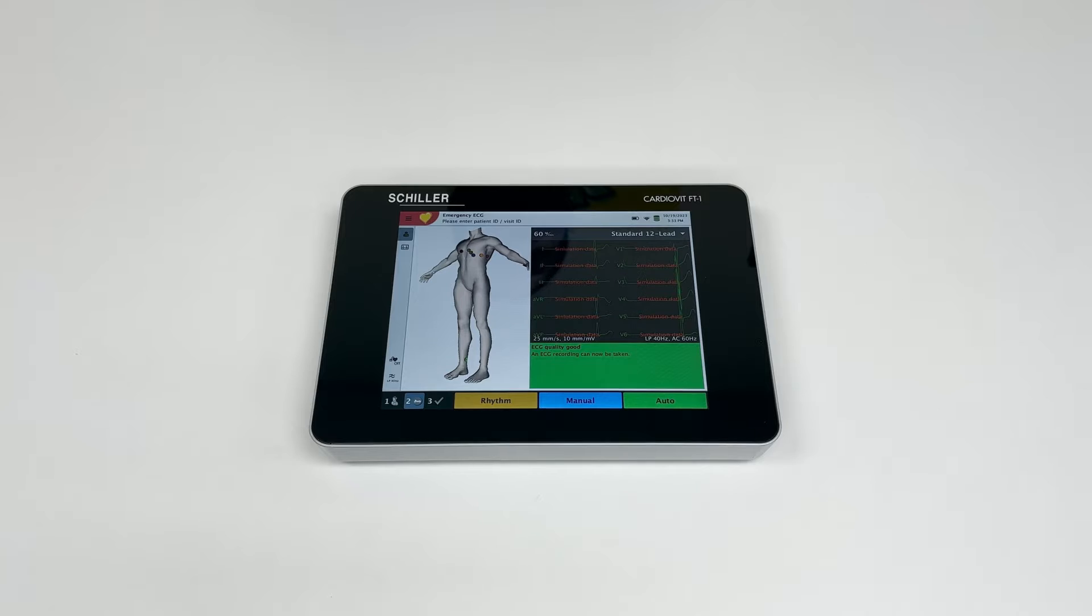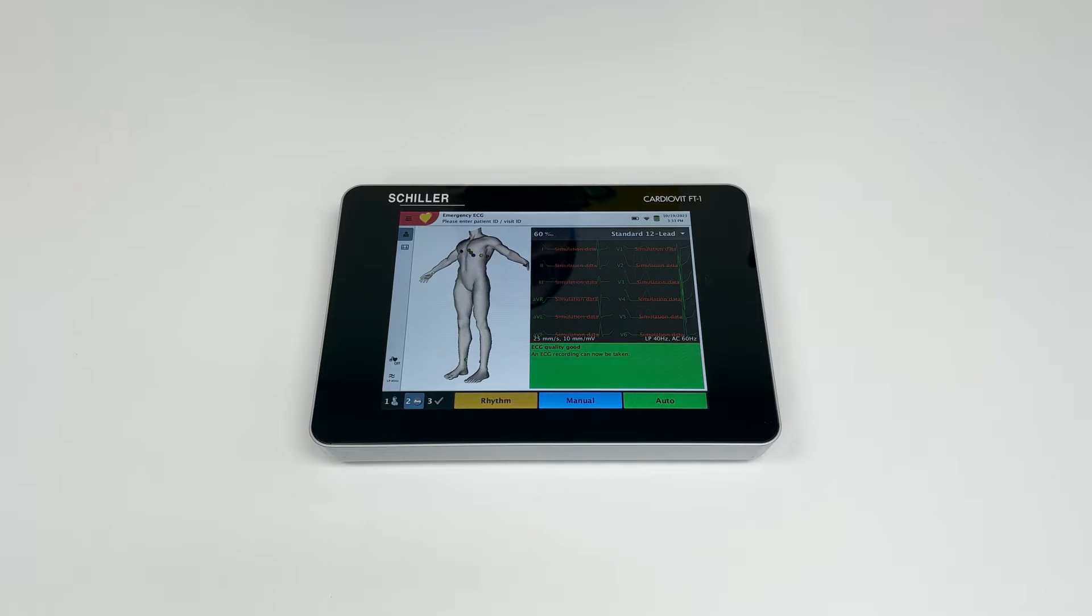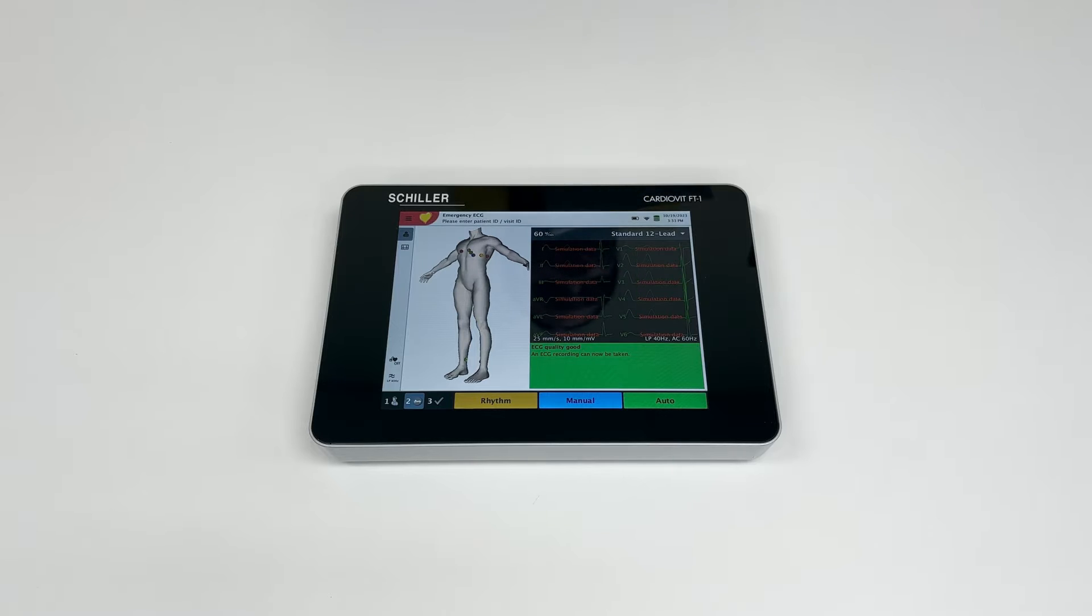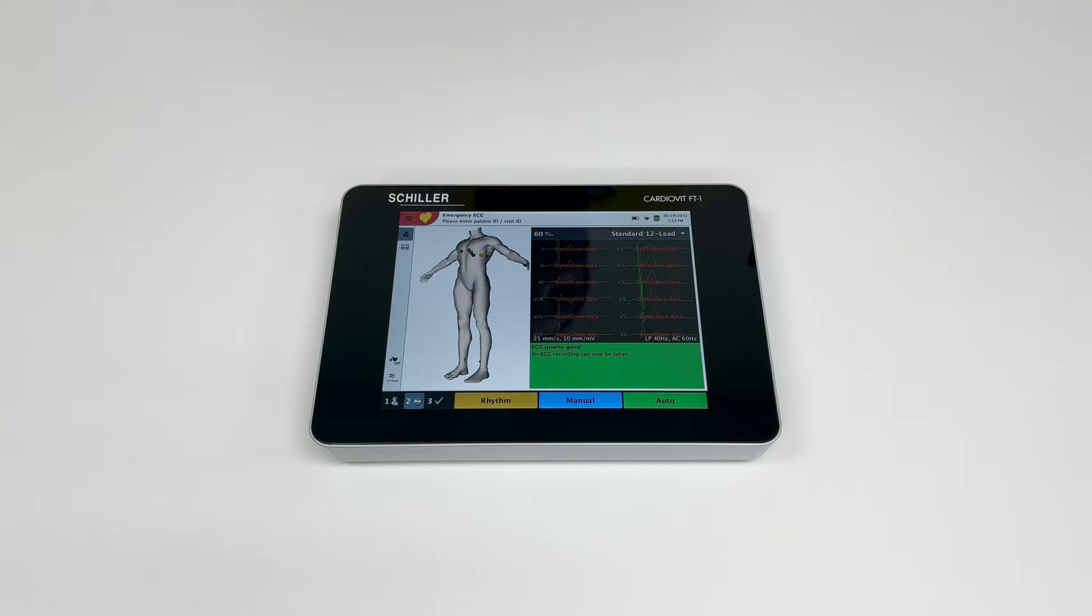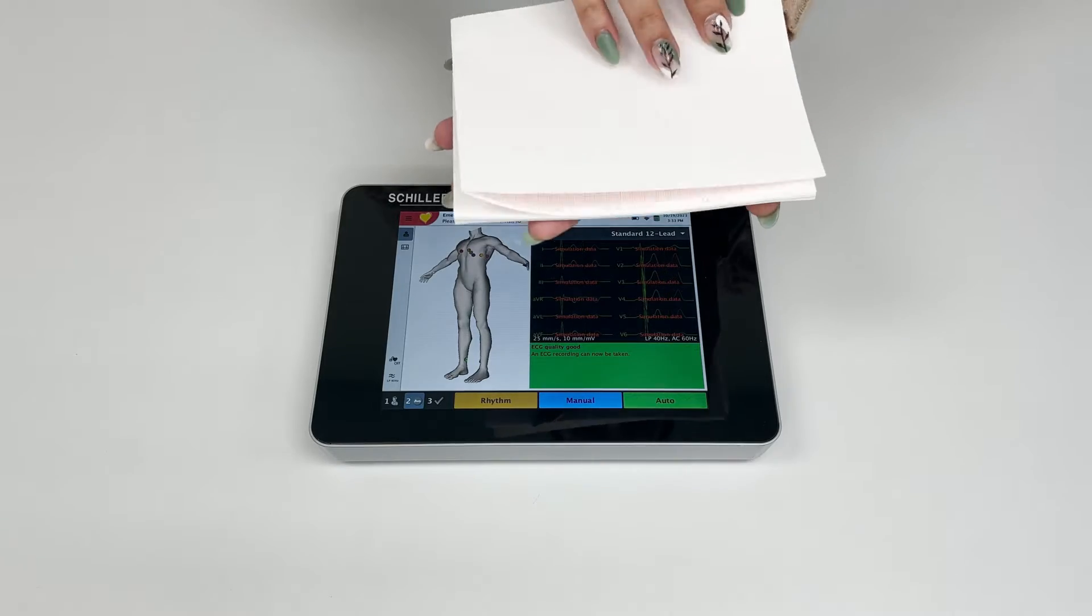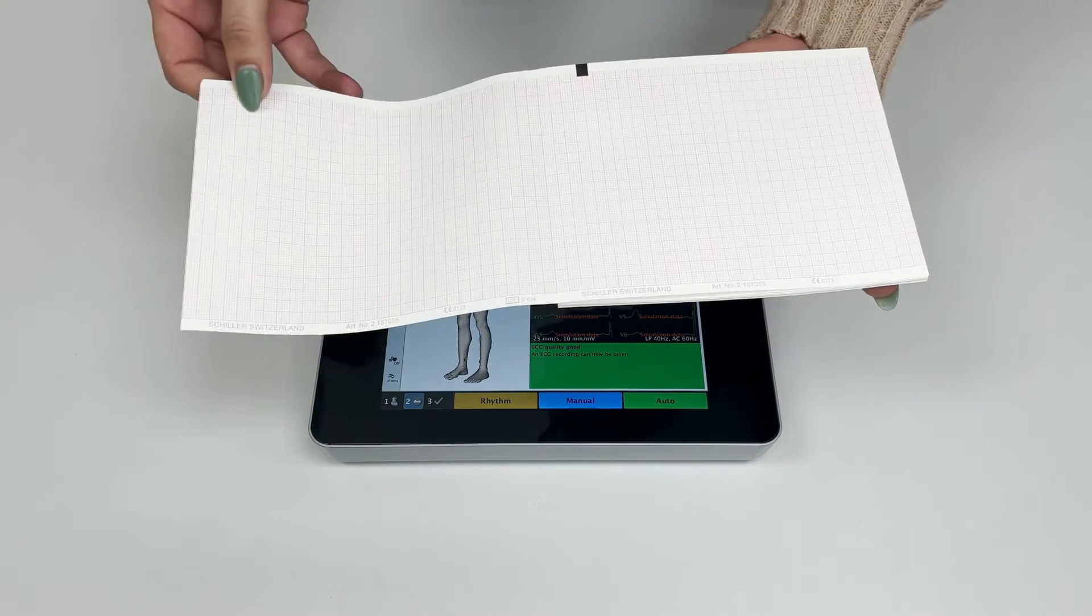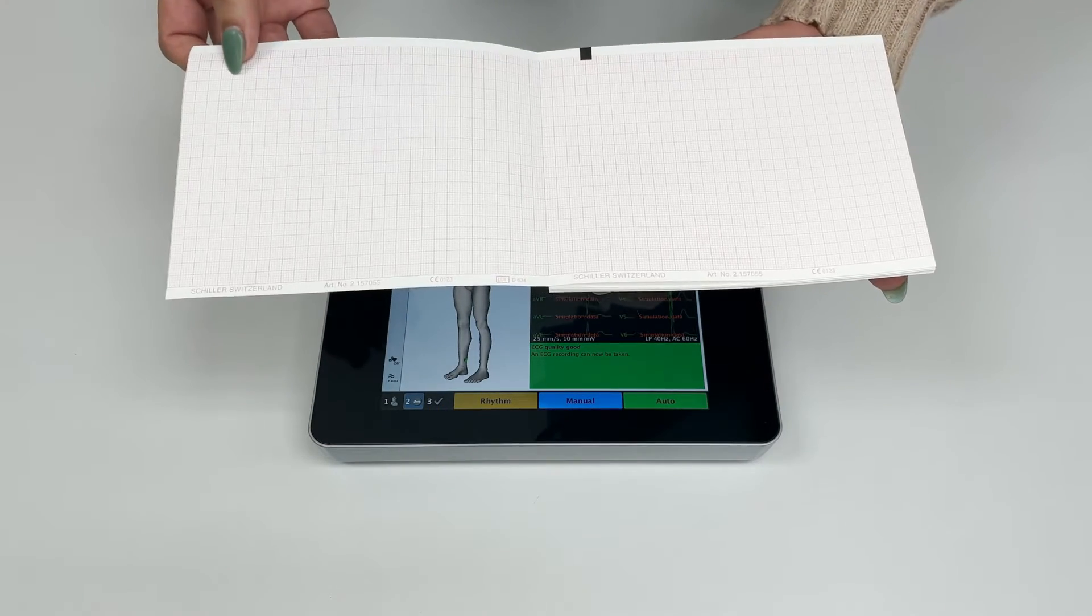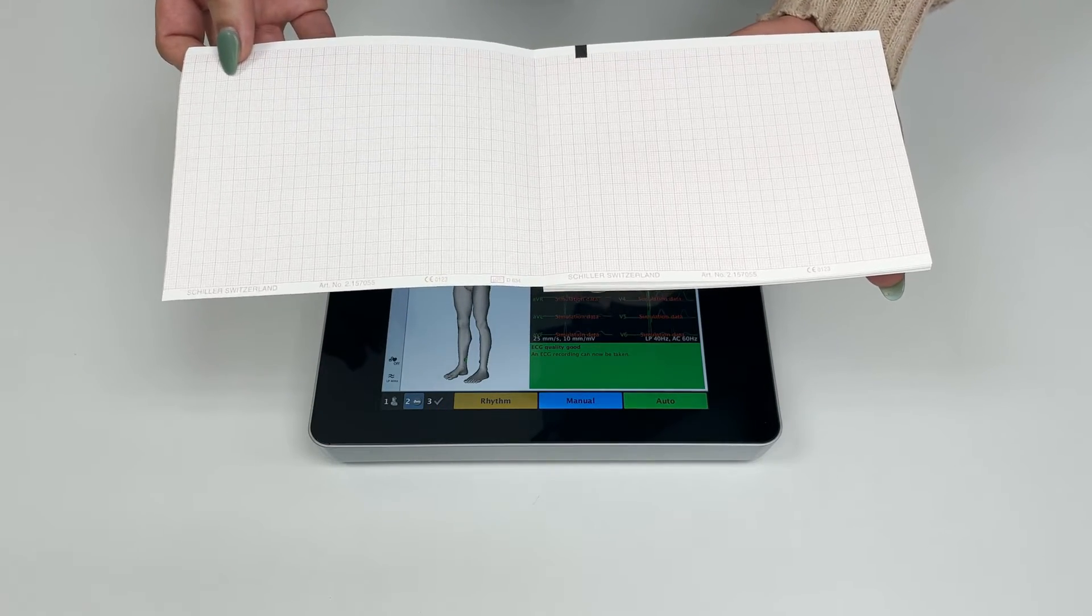Hello ladies and gentlemen, thank you for tuning in. In this video we will be discussing how to properly insert the paper on this FT1 EKG device. This is the EKG paper for the FT1.